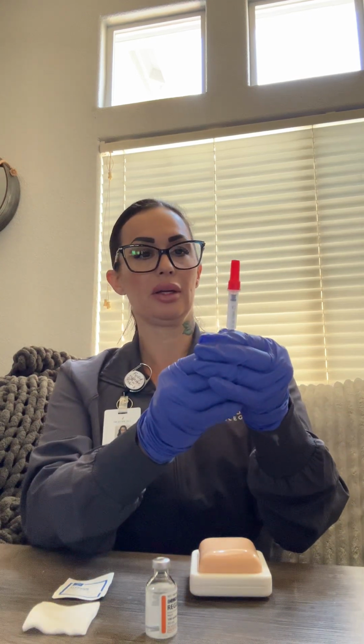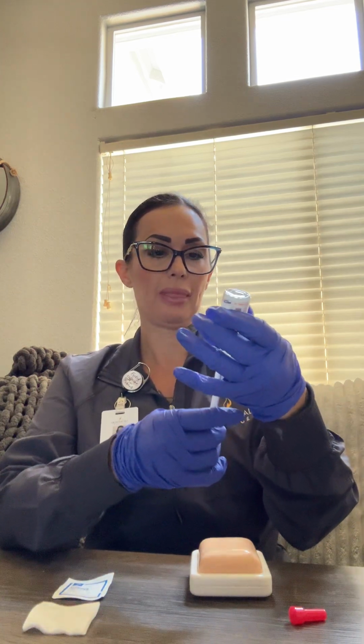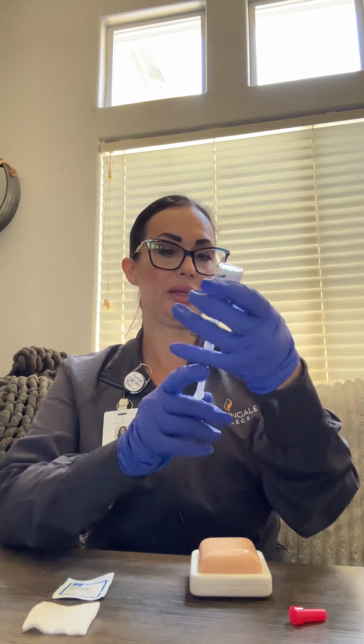You want to prepare medication. If you have a cap, you want to remove it. You want to wipe it down with alcohol to clean it. You're going to want to draw up with air the amount that you're going to be giving, which is 0.1. This time, you will carefully insert into the bottle and fill. You will now invert, and you will draw up your medication, which is going to be, again, the 0.1.